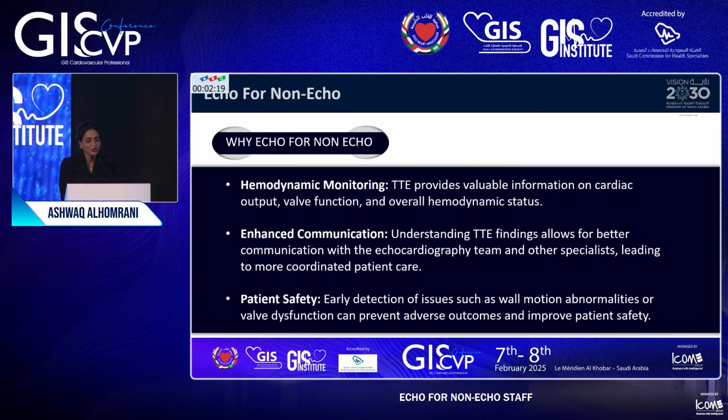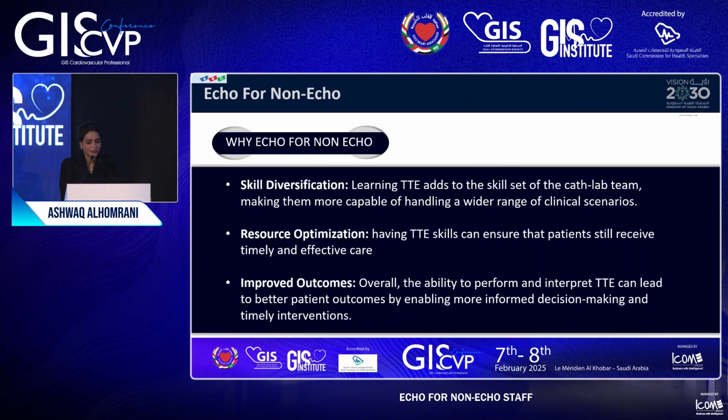Enhanced communication, especially for the cath staff. If they learn the TTE, it usually allows better communication with the echocardiogram team and other specialists, leading to coordinated patient care. Patient safety: early detection of issues such as wall motion abnormality or any valve dysfunction prevents adverse outcomes and improves patient safety.